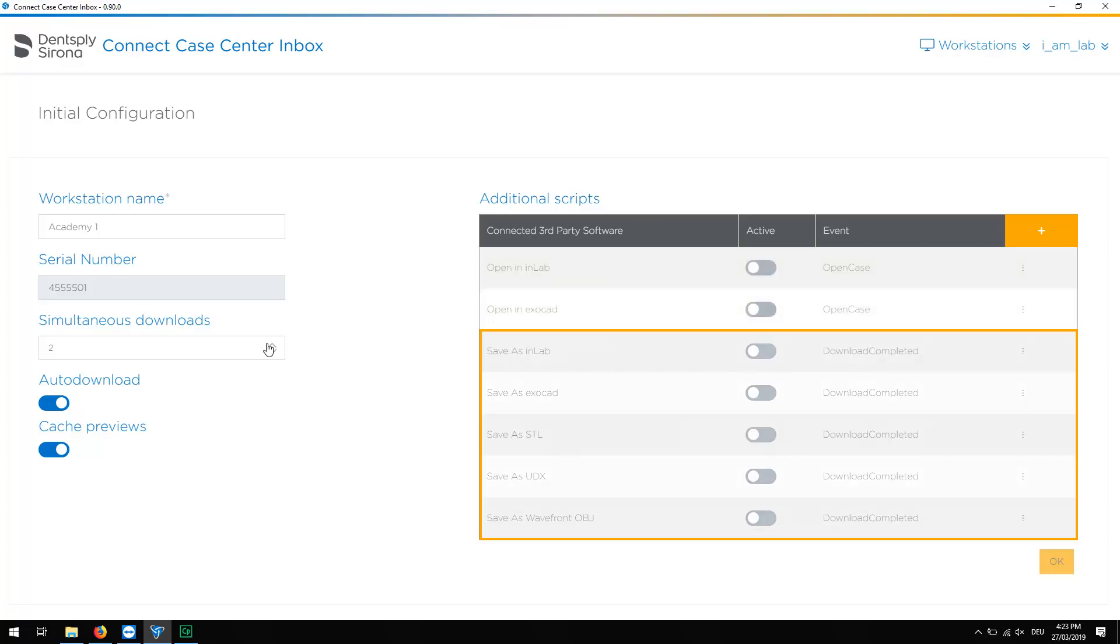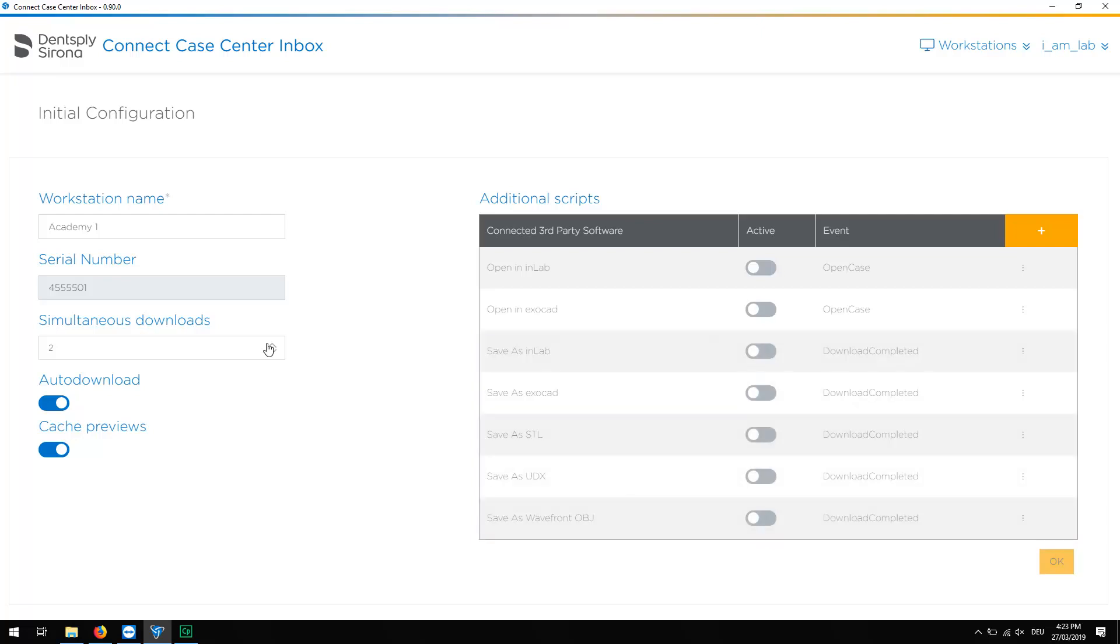Enabled scripts that display Save As provide the option to select an individual storage location for each case file. For demonstration purposes, we will enable the script Save As Wavefront OBJ first, then the script Open In InLab.